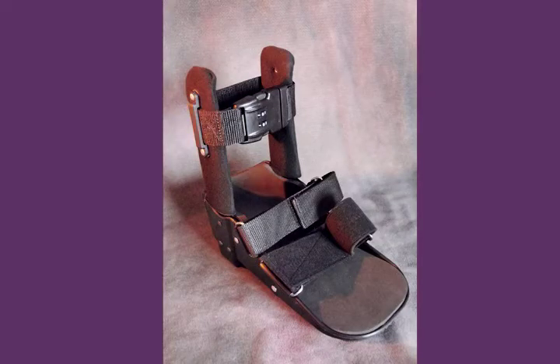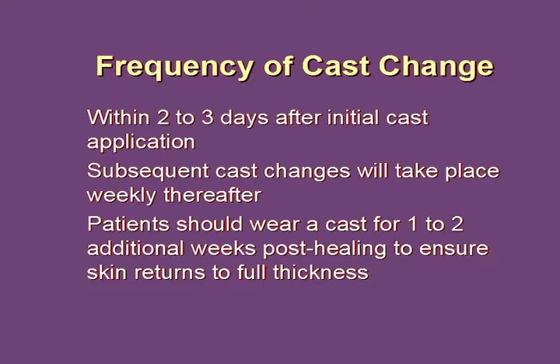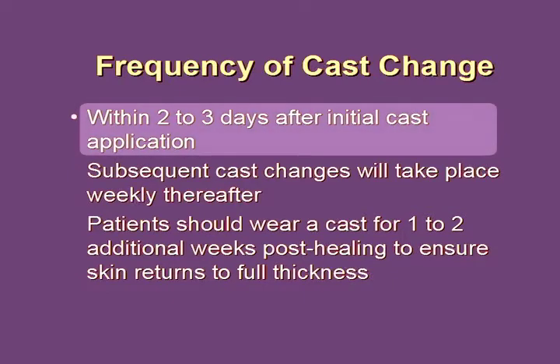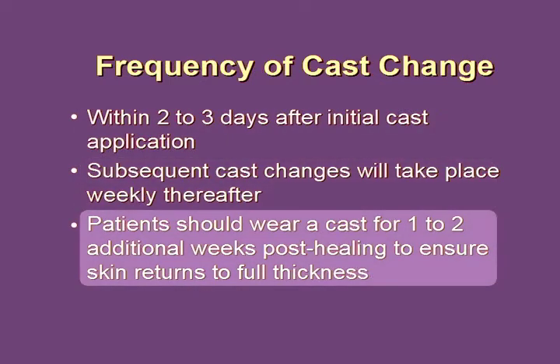Instruct the patient that the outer boot must be worn for ambulation. Ambulation without the boot will cause instability, could damage the cast, and delay progress. The first cast change will take place 2 to 3 days after the first cast is applied to prevent pistoning and maintain total contact as swelling in the leg decreases. Subsequent cast changes will take place weekly thereafter. Patients should wear a cast for 1 to 2 additional weeks post-healing to ensure the skin returns to full thickness.